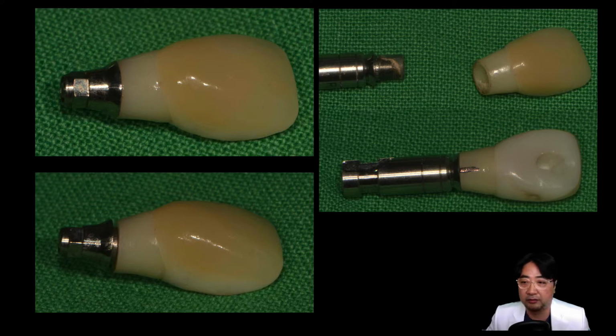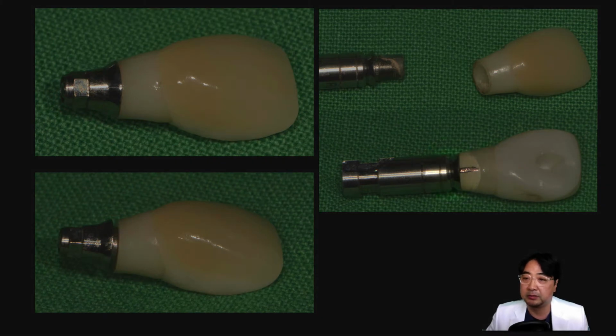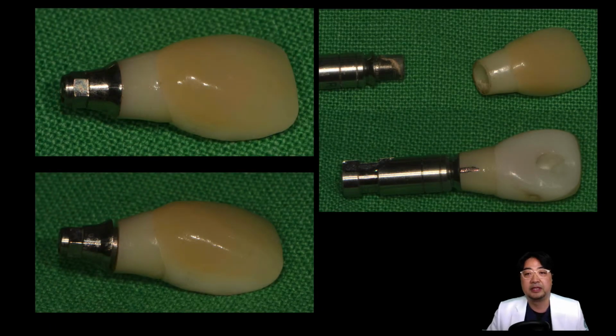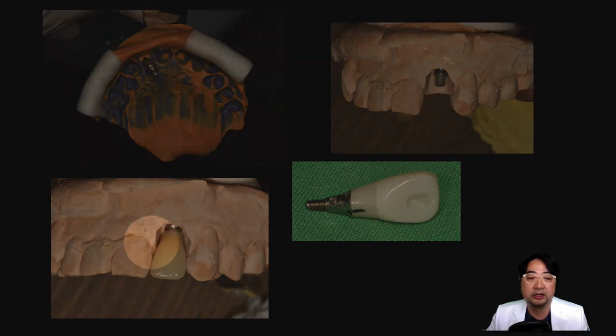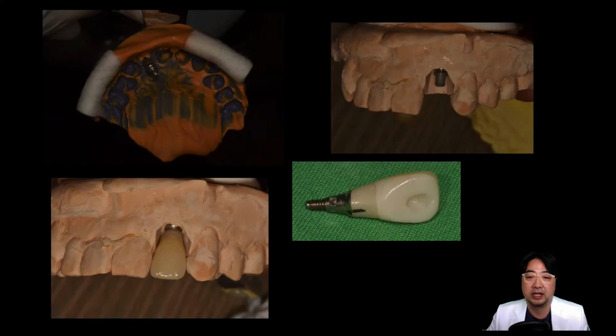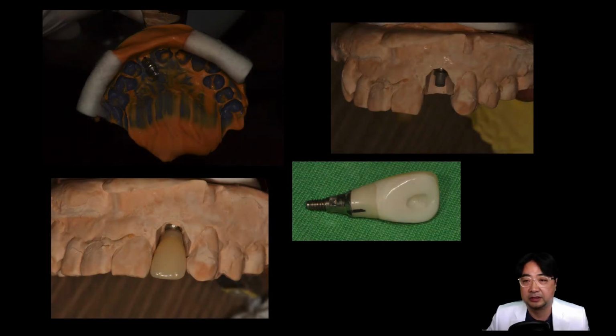But the problem was that there was a gap between the link abutment and the zirconia core. It was not stable enough to cement in the patient's mouth. So I decided to make an impression and a model, and I cemented it on the model. This patient had to go back without number 22 that day, the day the patient came because number 22 was mobile. So I had to ask him to come for another visit for delivery of the number 22 implant-supported link abutment zirconia crown case.